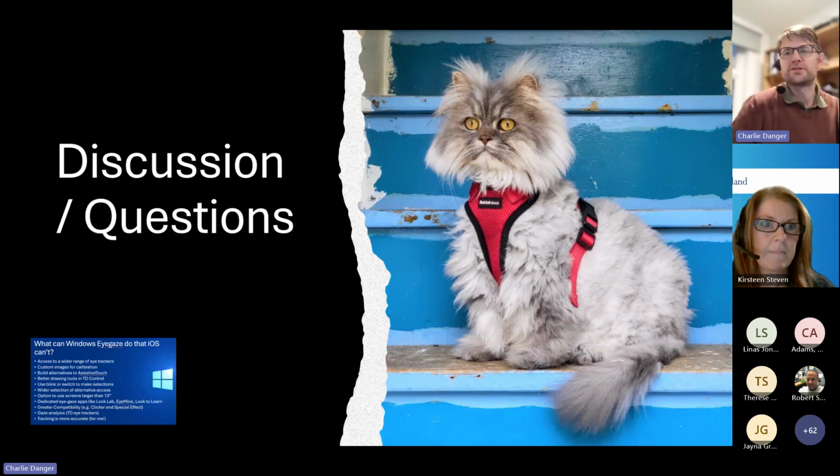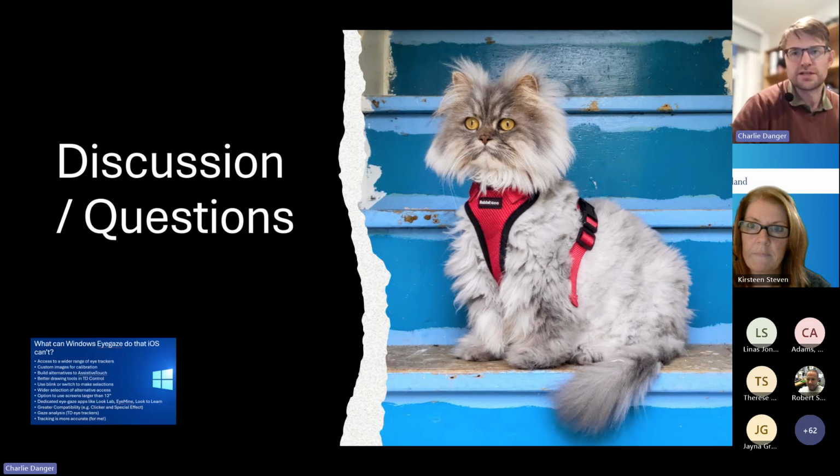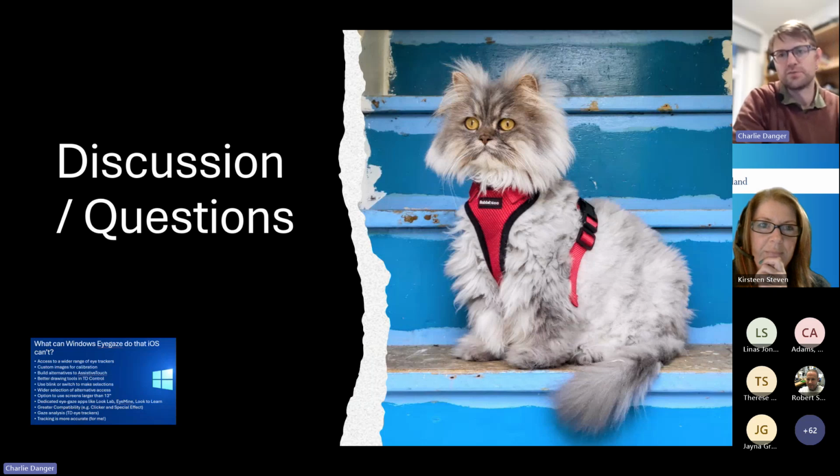We want them mounted securely. Sometimes we go to school and see them on a pile of books or something, but we have table mounts for that. And of course, we also mount to wheelchairs if somebody needed it. But just to confirm, none of the students here at SEMMAC are currently using Apple eye gaze, but many of them are using other forms of eye gaze.